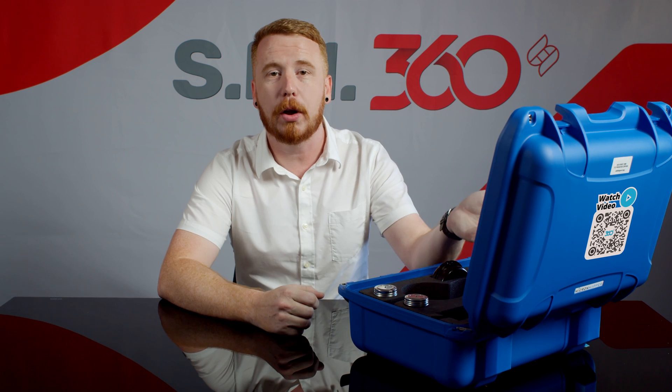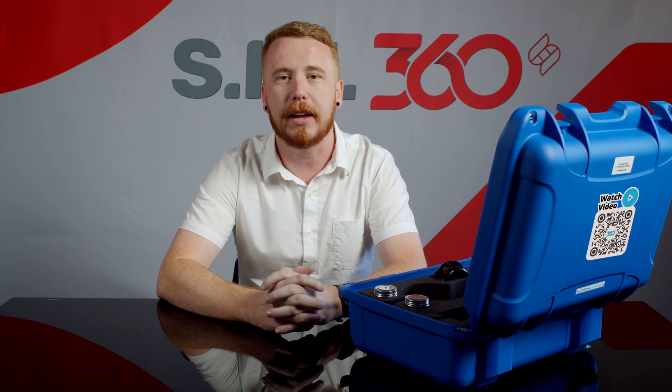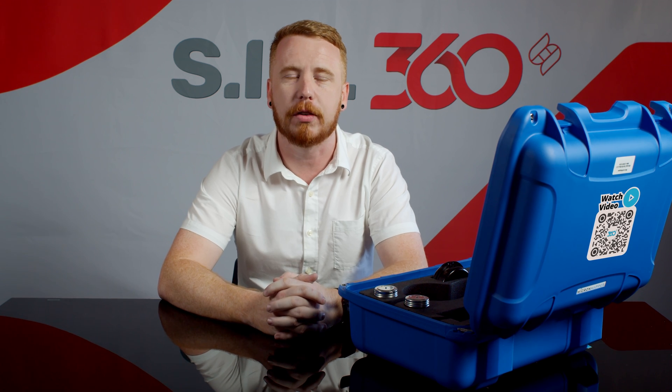To begin, you'll scan the QR code located on the outside of the package. This will provide you with a link to schedule the install and training with one of our digital solutions specialists.